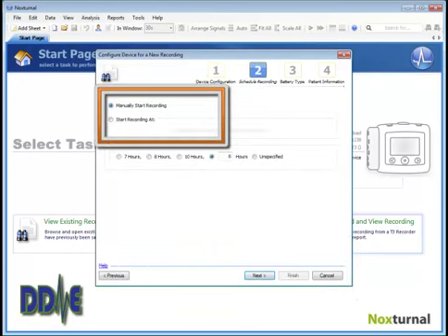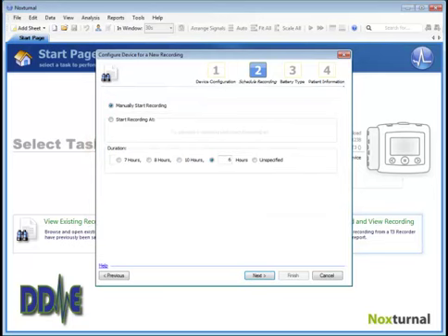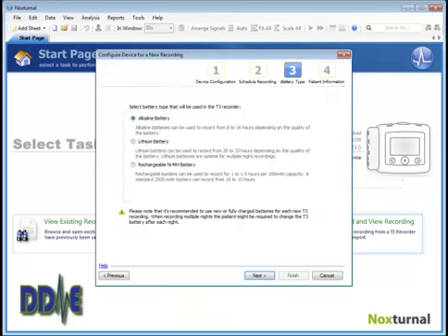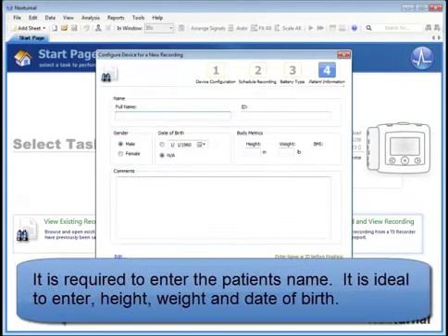Click Next, and you can auto-start the test by selecting the night number of days and time, or manually start the test, which requires you to give some instructions on how to start the study to the patient. Select the battery type, then click Next, and you are required to fill in the patient name.